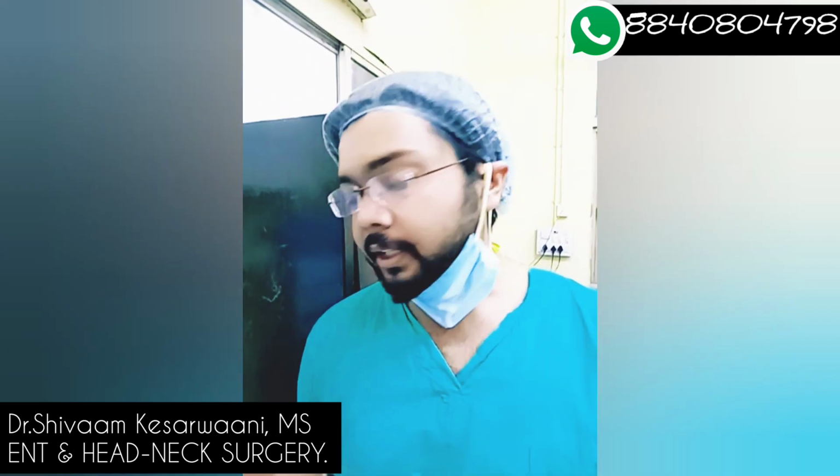In cases where we know that we are going to operate on an inverted papilloma, and if the patient presents to us with that same mass, we can say that it is a case of recurrence. Now, in our case, it is a case of residual. We can say that this is a residual tumor that we are going to operate.